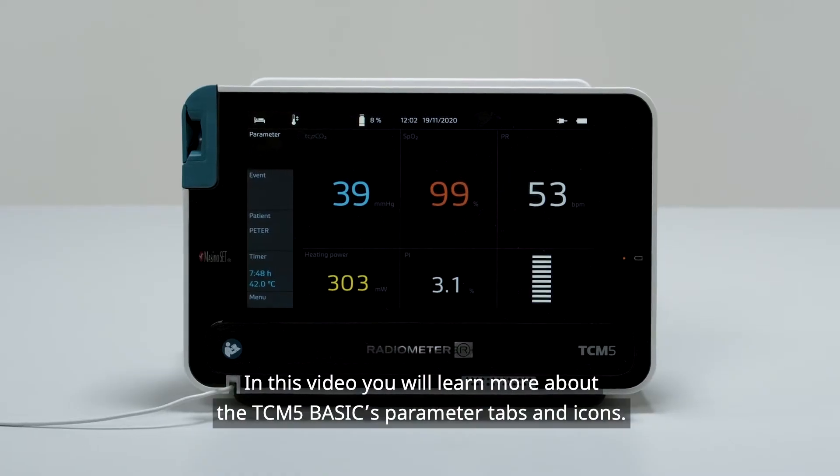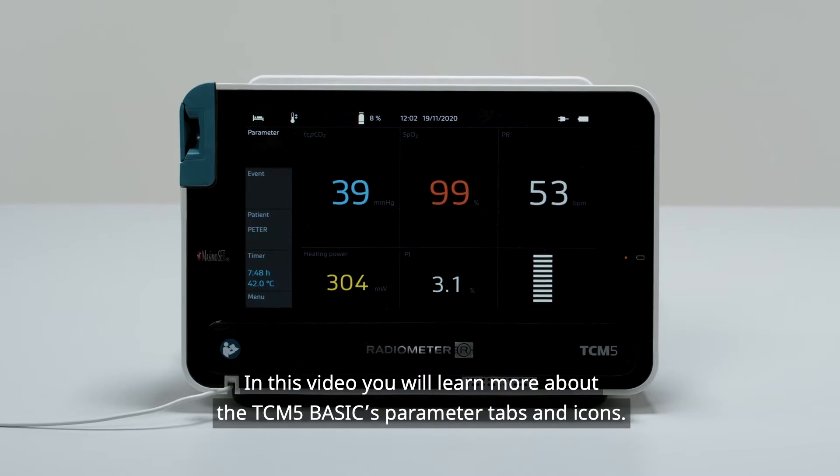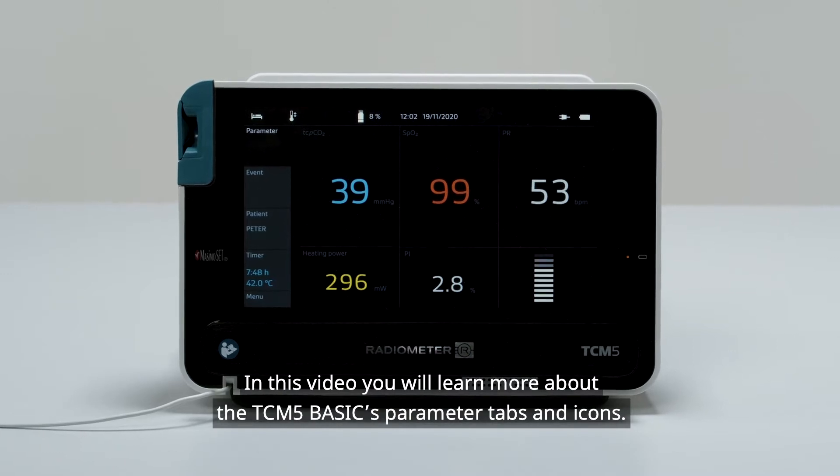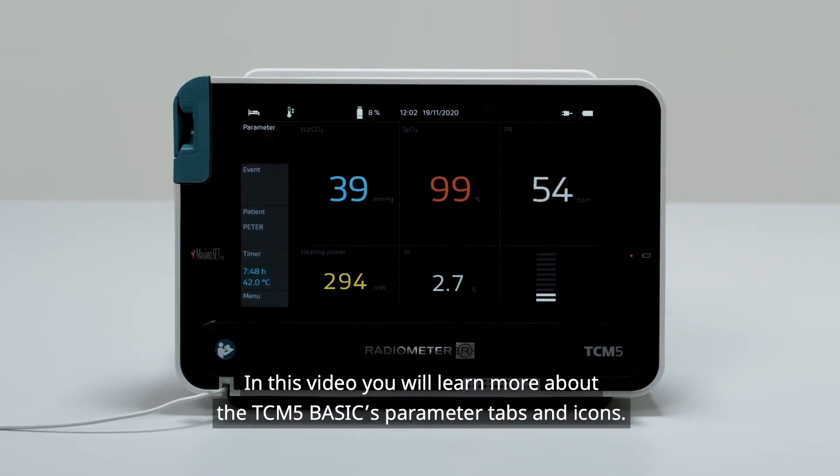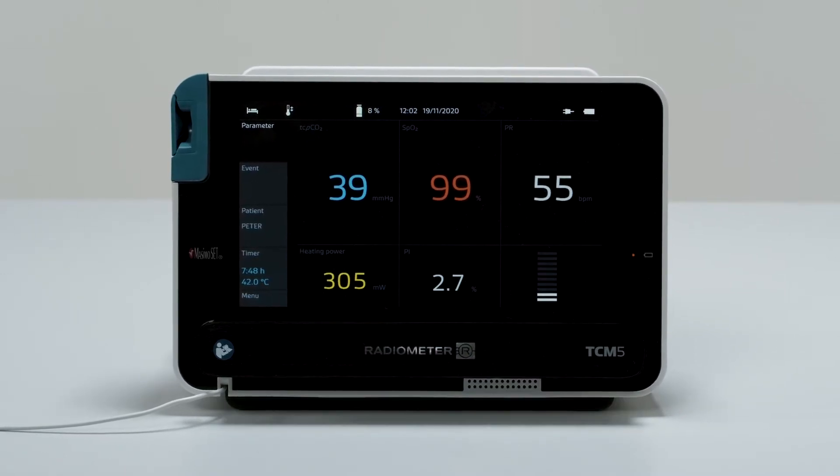In this video, you will learn more about the TCM-5 basics, parameter tabs, and icons.